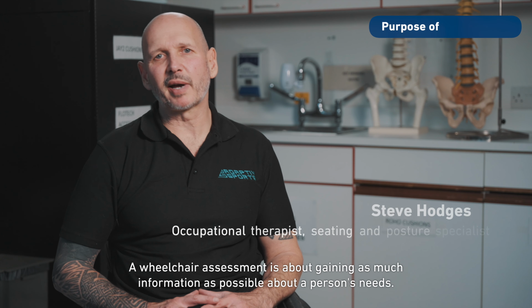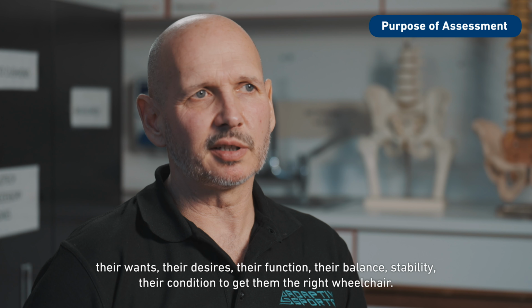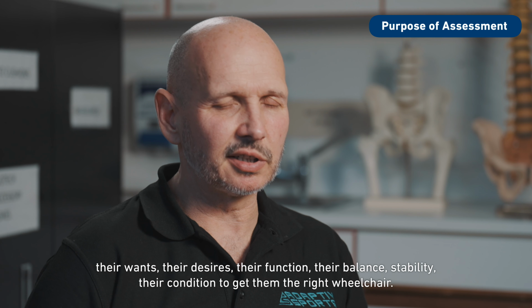A wheelchair assessment is about gaining as much information as possible about a person's needs, their wants, their desires, their function, their balance, stability, their condition, to get them the right wheelchair.